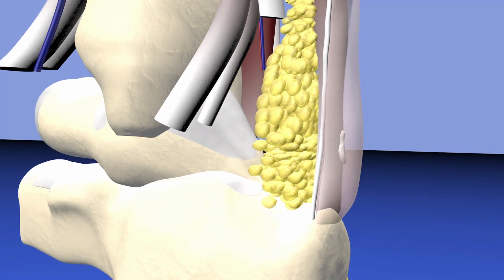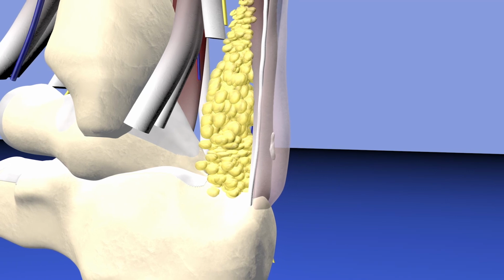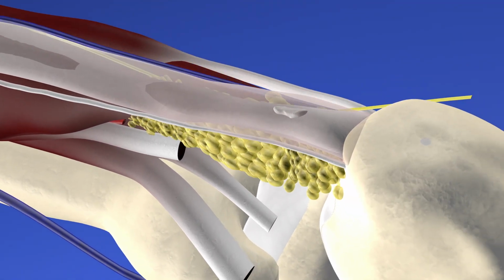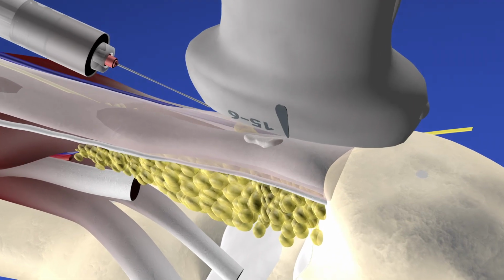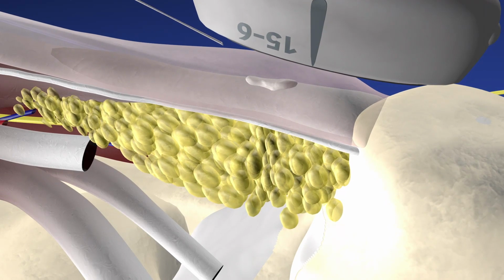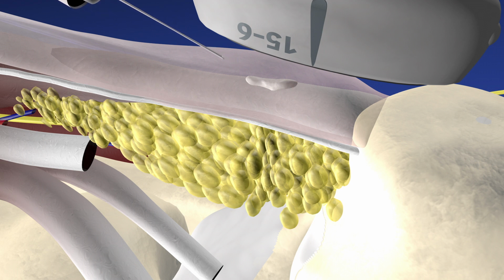Now the superficial aspect of the Achilles tendon is made transparent, so we can see this calcification that is also in her distal Achilles tendon. And we're bringing the lower extremity into position for the procedure. And here's our probe and our syringe. And initially we're going to do an ultrasound guided needle tenotomy / fenestration, and also try to break up that calcific density as well with the needle. See the needle essentially going into and out of the tendon and this calcific density as well.